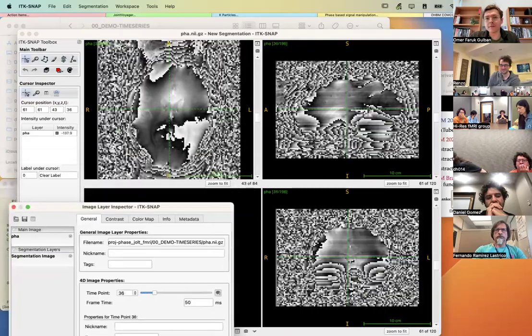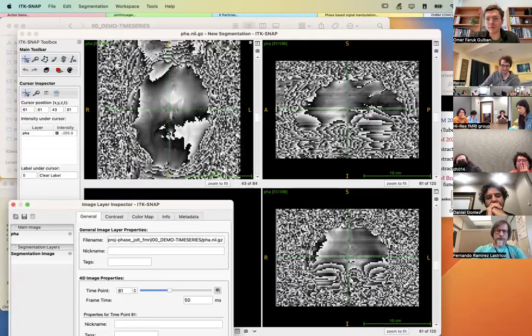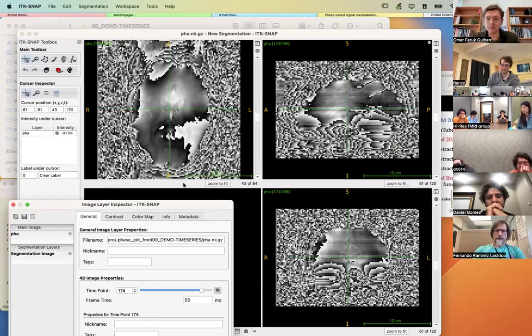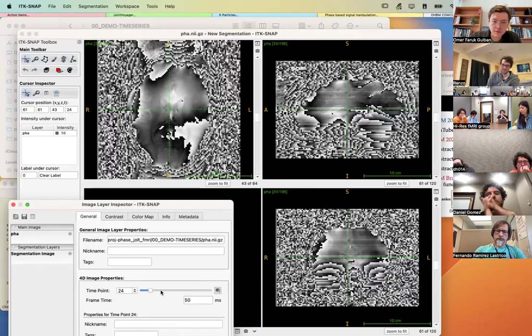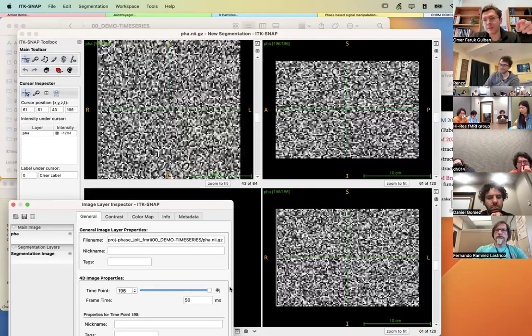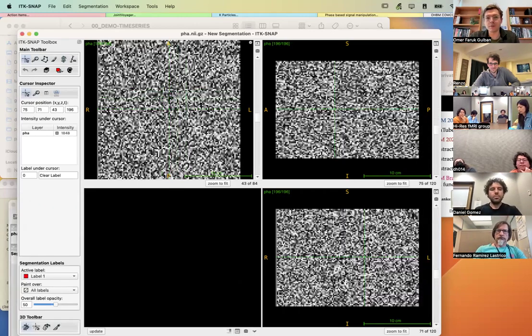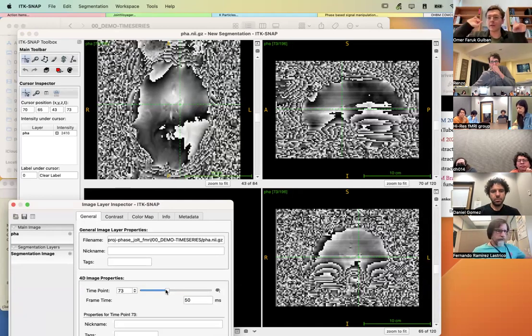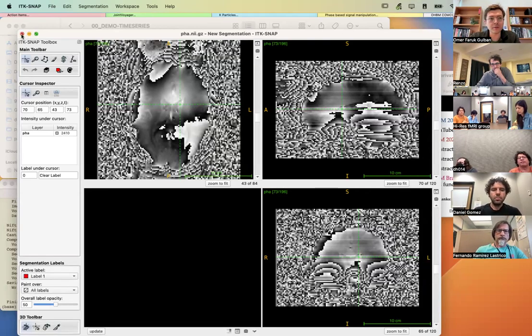So for instance, this is a different data set, much more conventional, and you do not see that large washing over effect. And maybe this answers your question somewhat. This is a Nordic compatible data set, so they have the noise scan at the end, which is actually useful to have. When you don't have signal from the brain, you see the actual distribution of the phase, which is a completely uniform distribution, of course. But when you have the brain with high signal, it constrains the phase values that you can measure, thinking of the complex valued signal.